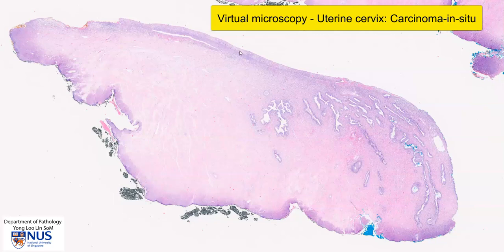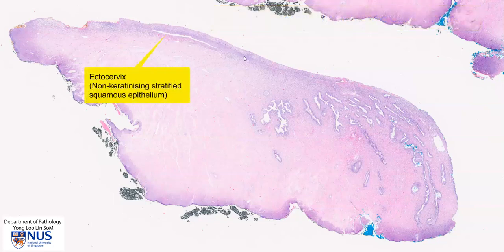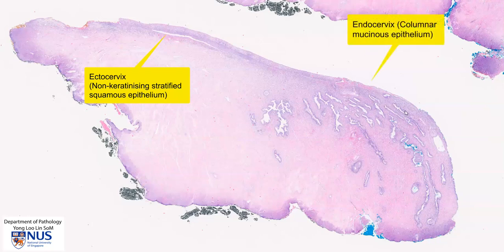Here is the mucosa of the cervix. On the left side we have the ectocervix, which is composed of non-keratinizing stratified squamous epithelium, and moving towards this edge, this is the endocervix, which is comprised of columnar mucinous epithelium.